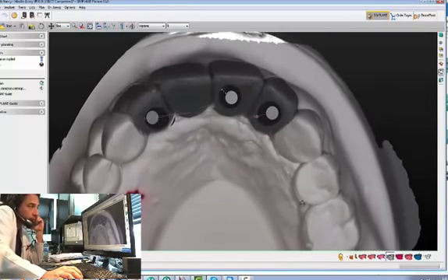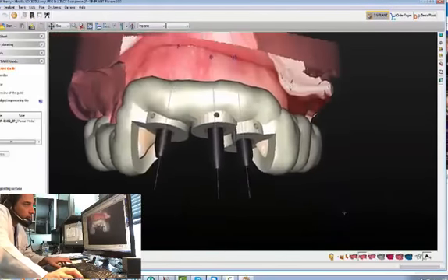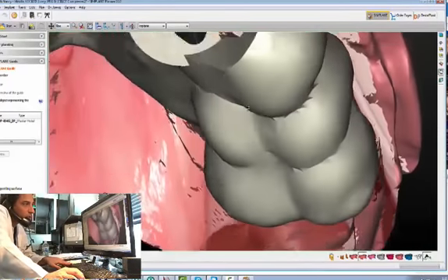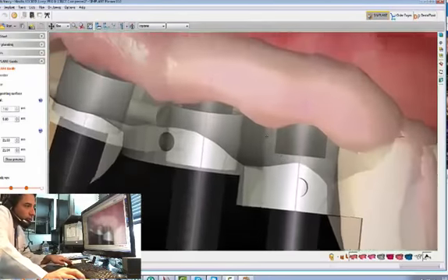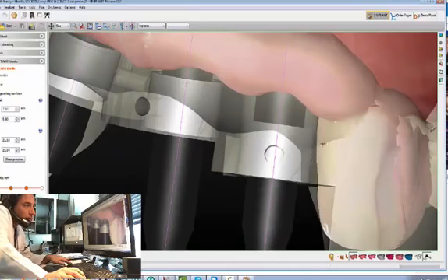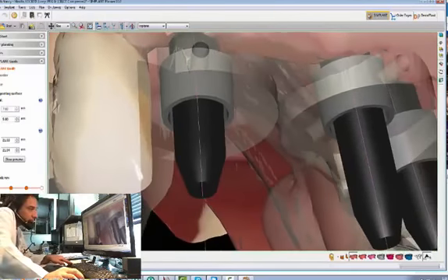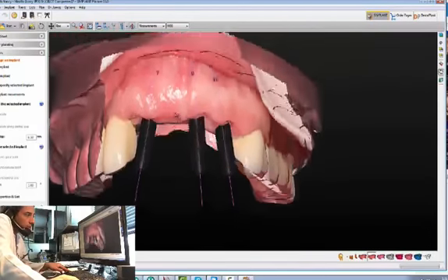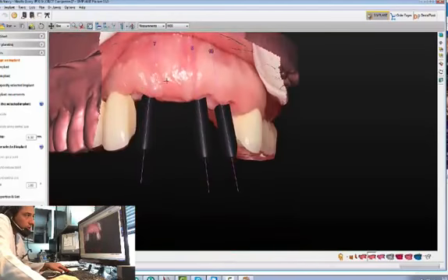Here we have the pure wax-up and the trajectory of the implants. Take a snapshot of it and we'll see if we can get there. Here's your surgical guide — a representation of it. You see there are windows on the canine because it's pretty close. You see the guide has tubes that are almost bordering the tooth, at least on number 11 and also on number 6 — it's pretty tight. I think we can do it flapless. You see where the tissue is — all this keratinized tissue. We don't have to touch it because the implants are actually going in more palatally, right in here. So there's no issue with mucosa.